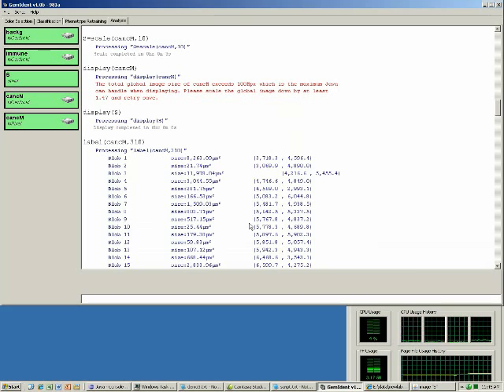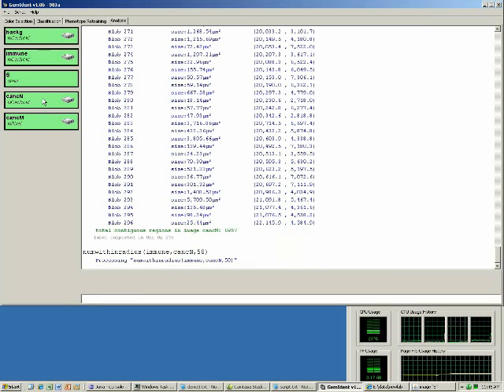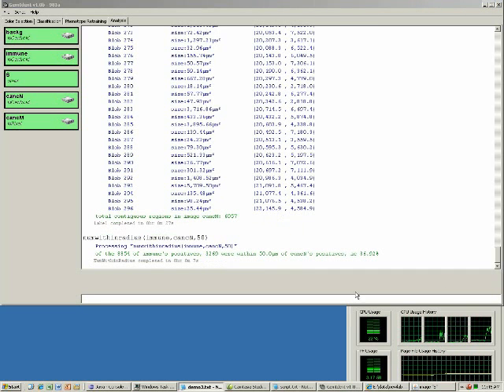Now, it may be interesting to investigate how close one cell population is to another. Let's see how many immune cells are within 50 microns of a metastasis. We'll use the num within radius function. How about the number between 50 and 100 microns away? We'll use the num within ring function.